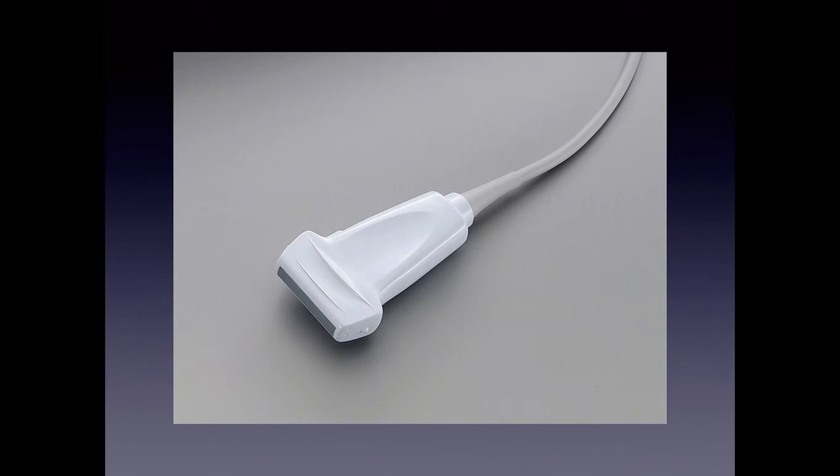For our technique, we're going to use the linear probe. This probe has the highest resolution of all our probes. Resolution is inversely related to penetration, so the higher the resolution, the less penetration. This penetrates about 7 centimeters, and you want to use this probe for central lines, abscesses, IVs. You could use it for a child with appendicitis since they're likely skinny, but just know you need everything within about 7 centimeters.